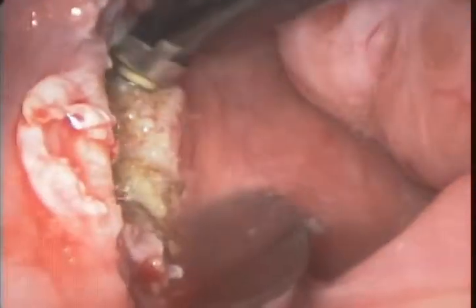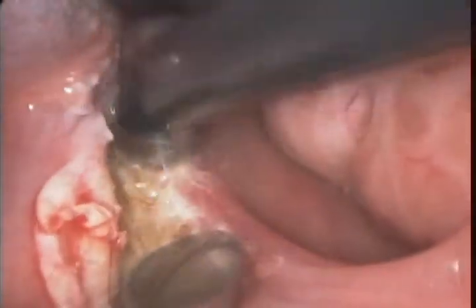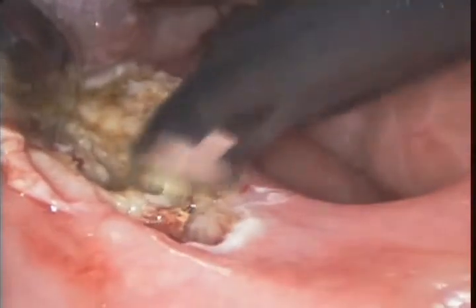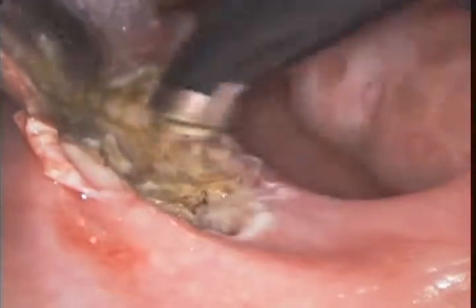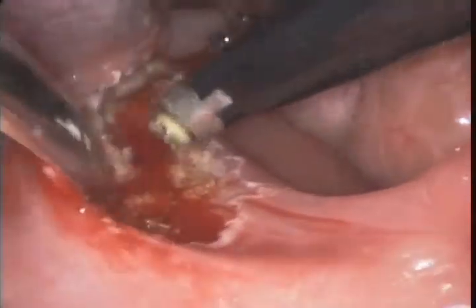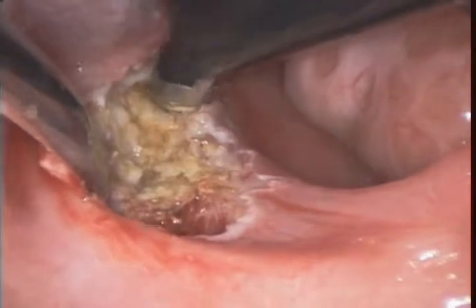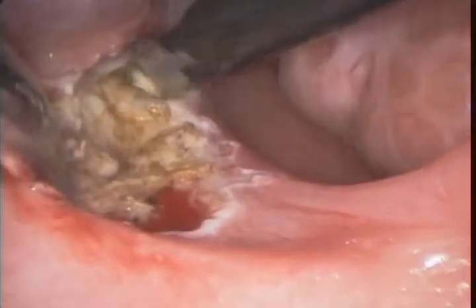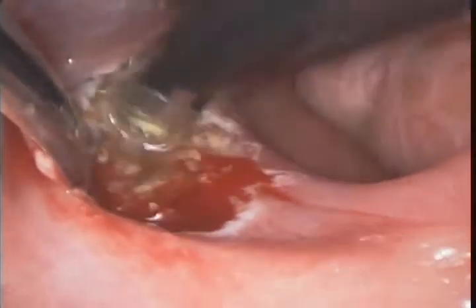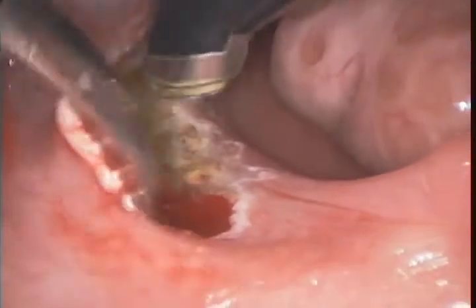The second thing that happens is you actually get better coagulation at lower settings. So at the higher setting, you get much more aggressive ablation and less coagulation. And then at the lower settings, you get slower ablation and more coagulation. So here we're retracting the tonsil pillar. And now what you're trying to create is the actual concavity of the tonsil fossa, without penetrating through the capsule.